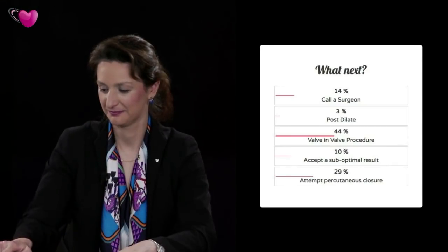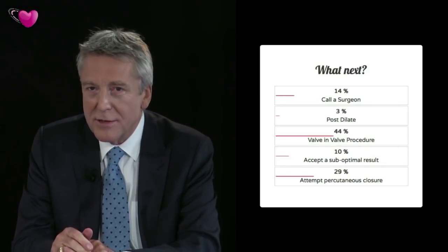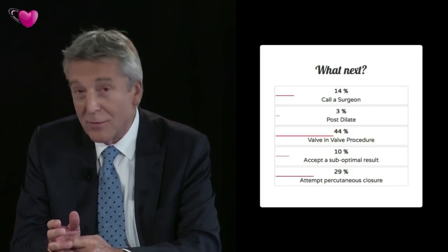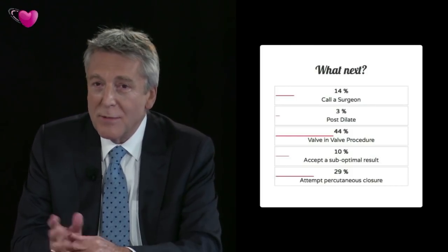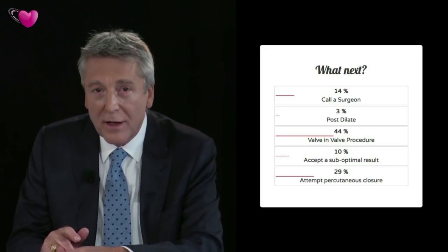So I think it's very likely the same thing will happen the third time, and we just risk complications. But the patient had been through a lot that day, and we'd all been through quite a lot as well. So we decided to bring the patient back in a couple of weeks and to attempt a percutaneous closure.